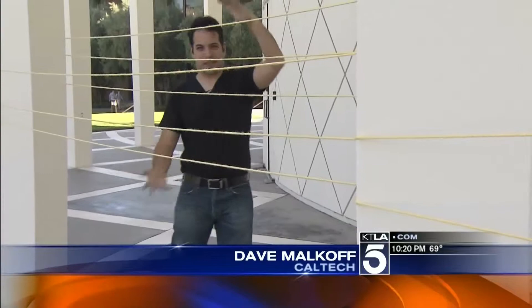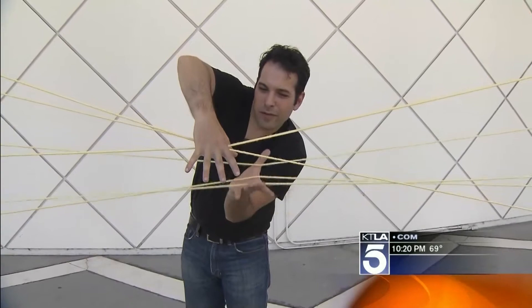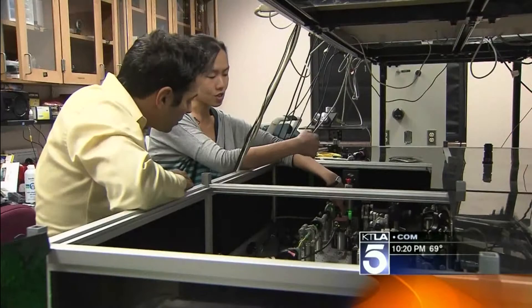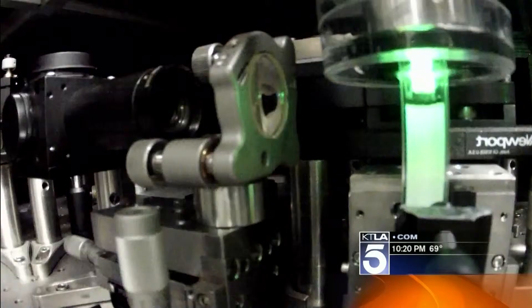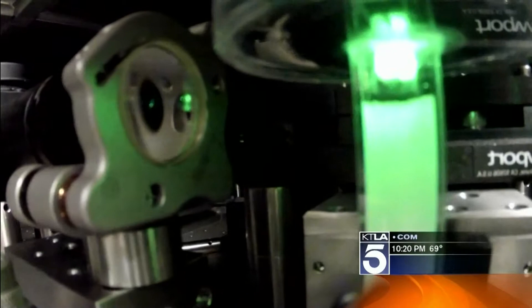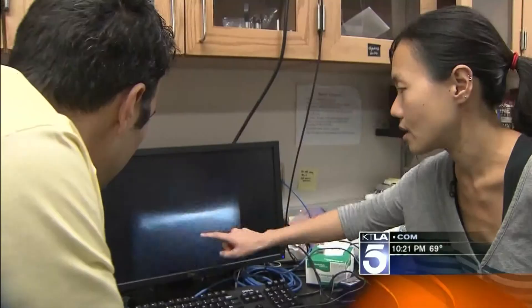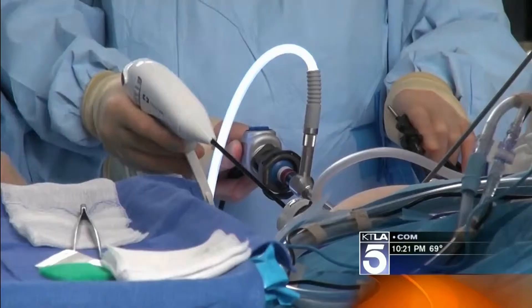When you get inside the body, it gets even more crazy and chaotic. What they've discovered is if you take some ultrasonic waves and use some video playback technology, it brings the laser back to that focus point inside your body, and that's where you can do the surgery. The laser and the ultrasound will be interacting in my finger. Here's their digital camera, and here's their ultrasound speaker right above the chicken. Together, they direct the laser to cut something inside the body without hurting your skin. You can see that the region of highest intensity is moving along.